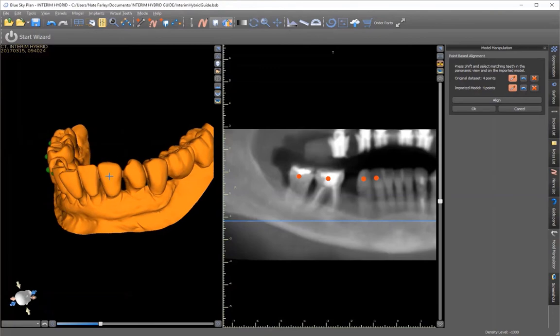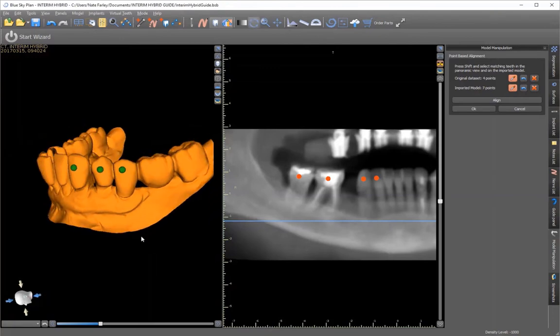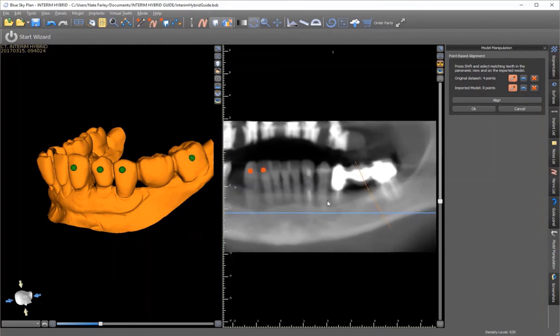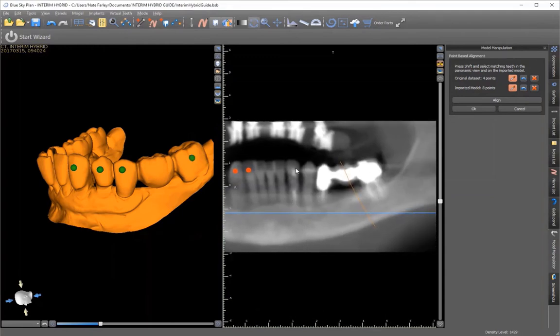As I said in the other video, I try to mix it up a bit and skip different teeth on either side. The reason I do that is to try not to confuse the software into bringing the scan in upside down.